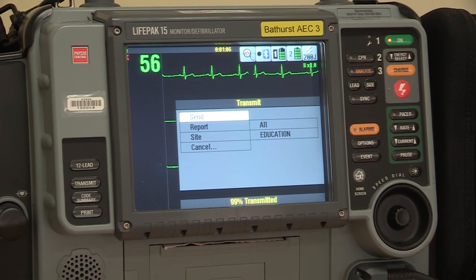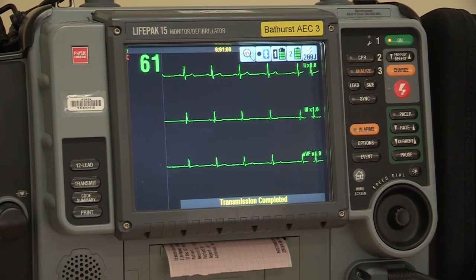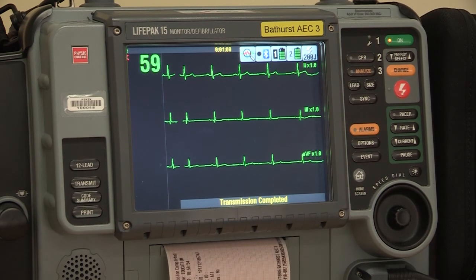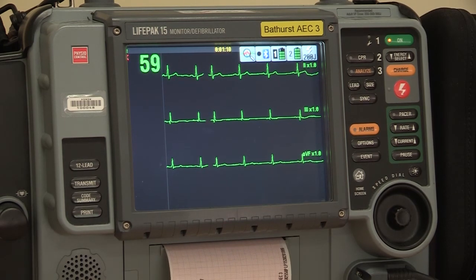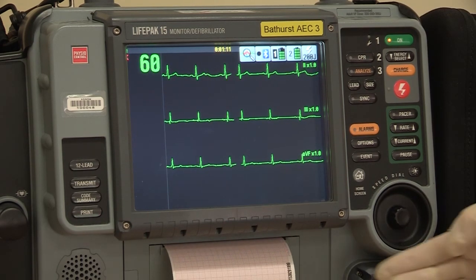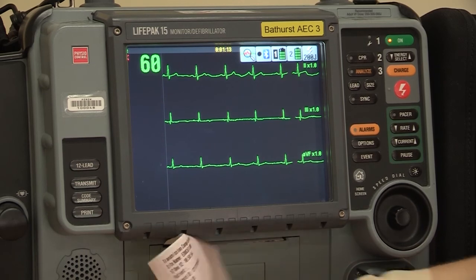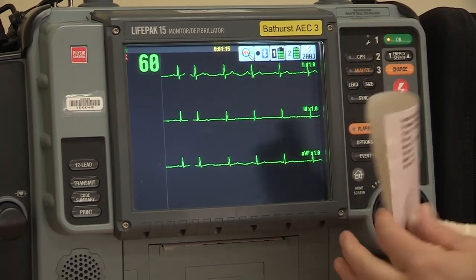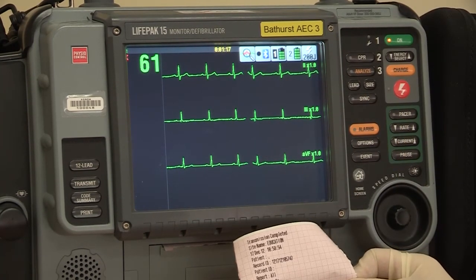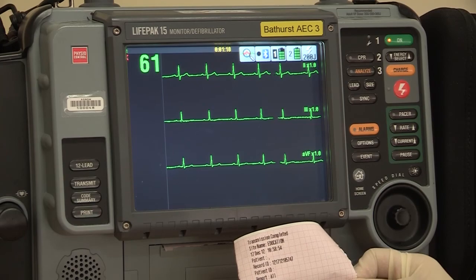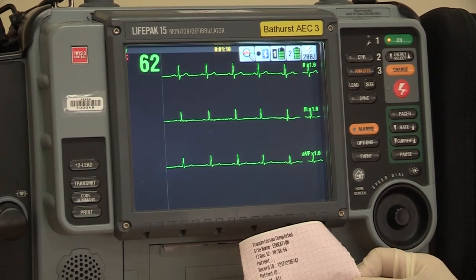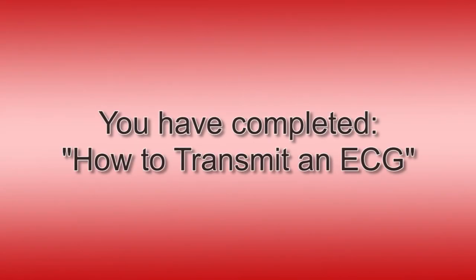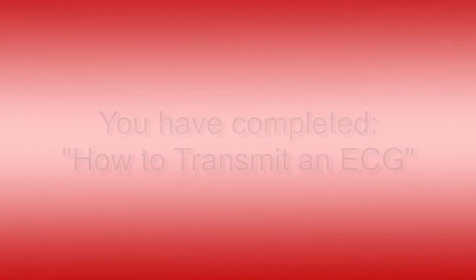When it is complete, the machine will print a transmission summary. At this point, depending on which ambulance service you are working for, your choices may be administering thrombolytics or waiting for a call from the hospital for advice about treatment options. Well done — you have now completed transmitting a 12-lead. Thank you very much.